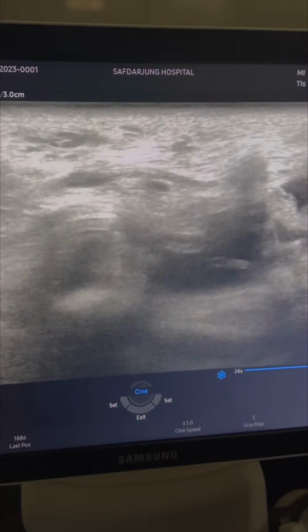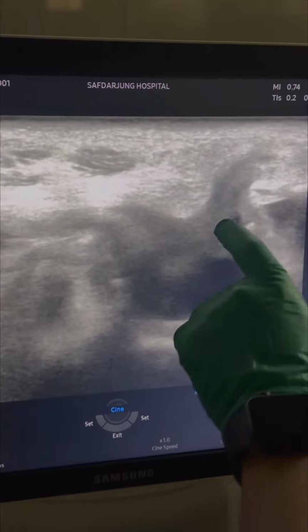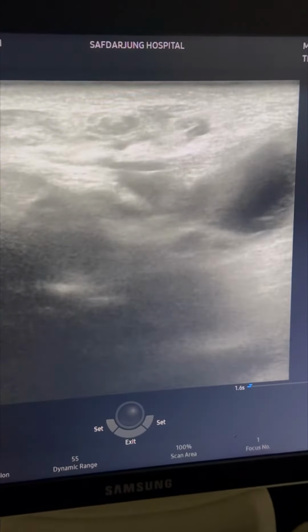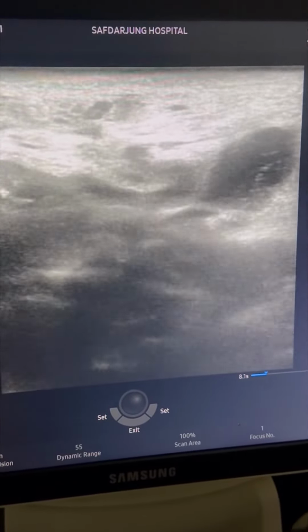Here we see large cystic structures covered with dura or meninges with nerve roots floating inside it, and it is communicating in the subcutaneous plane through the spina bifida. We have to make note that the superficial skin is intact, and therefore it will be a case of closed spinal dysraphism.